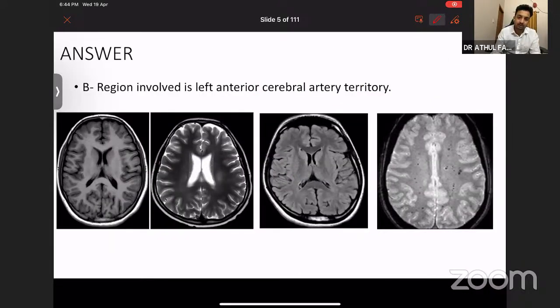Now coming to the other things, you should know how to find out each and every sequence. This identifying of sequences was asked in 2018, 2019, 2020, those periods, three or four years back; they used to ask you to identify the sequences. Still they can ask you, so you should know how to identify the sequence. So first we will see one by one. So the first image, okay. We will go step by step.